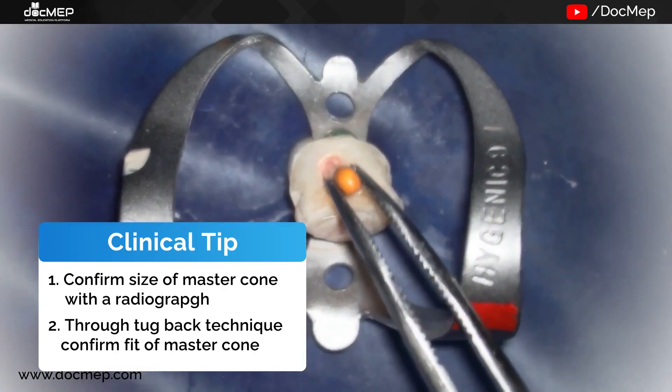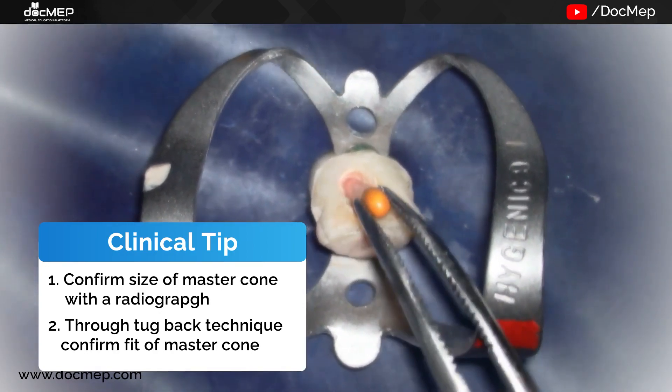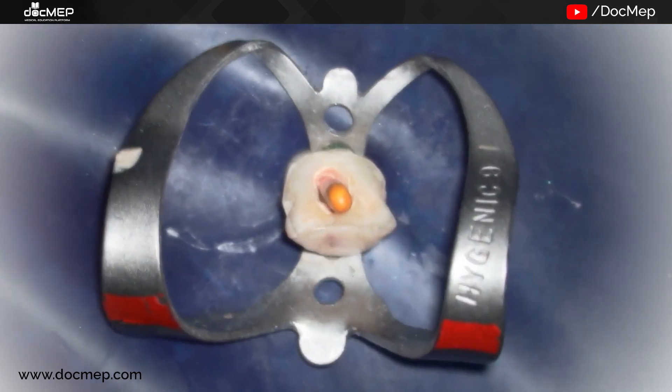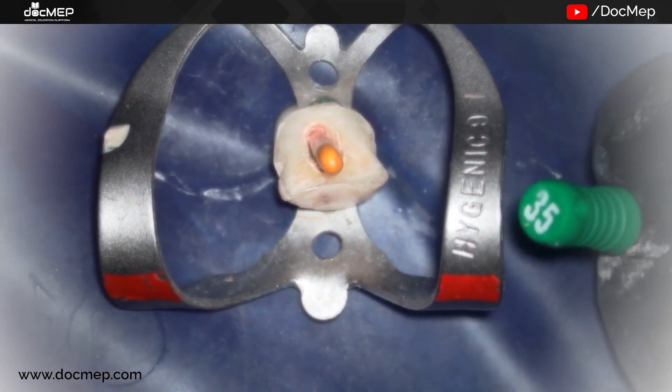We check the fit of the cone to see whether it is loose or tight. If it is tight, we don't disturb it any further. Once the cone is placed, we check for spaces around it by using our spreaders.